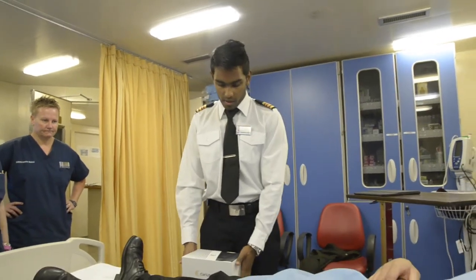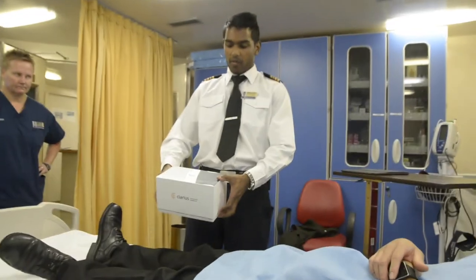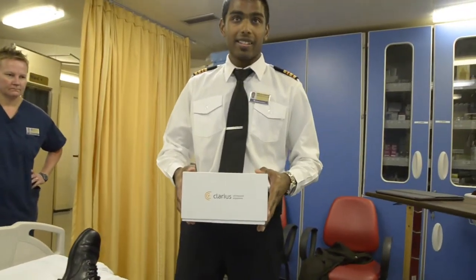What we're going to do today is showcase this new device that we just bought in Vancouver. It's called the Clarius ultrasound wireless device.